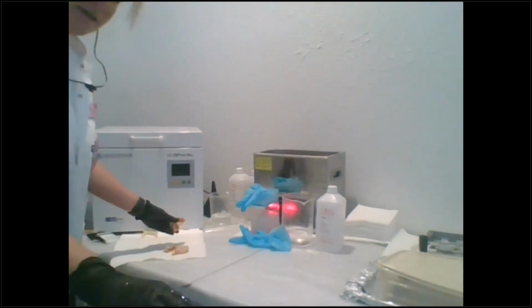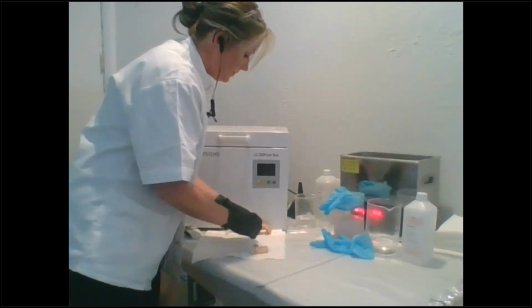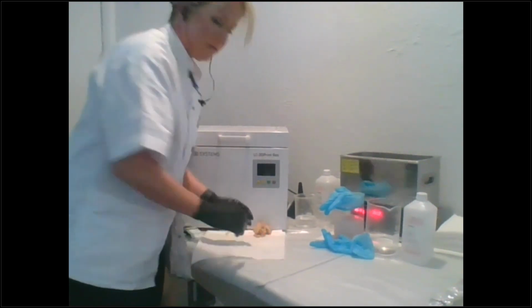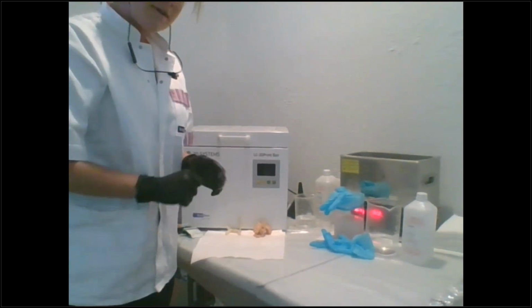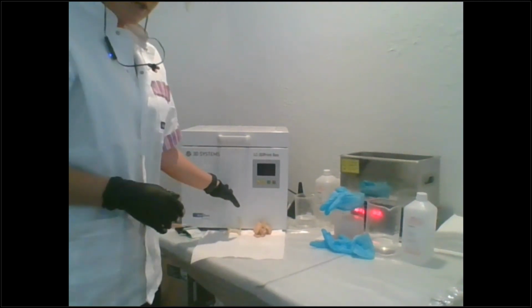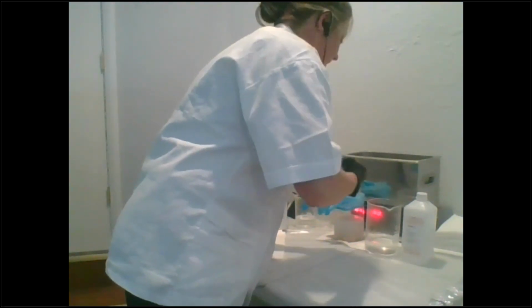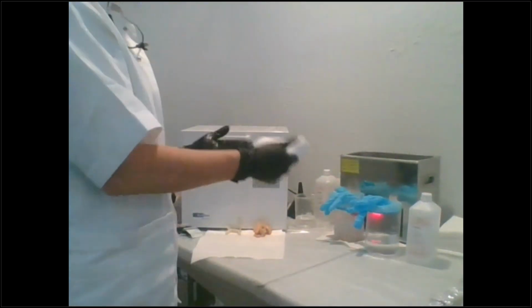And so when I set my parts up, I set them up like at an angle. I just kind of lean them against each other. Or obviously, I'm not working in a lab right now. I'm working in my home office, so I don't have an air hose. But if you have an air hose, just go ahead and spray them off and let them sit for a few minutes before you put them in the cure oven. Now, if you have lab analogs like I have here, I'm just going to wipe my hands.